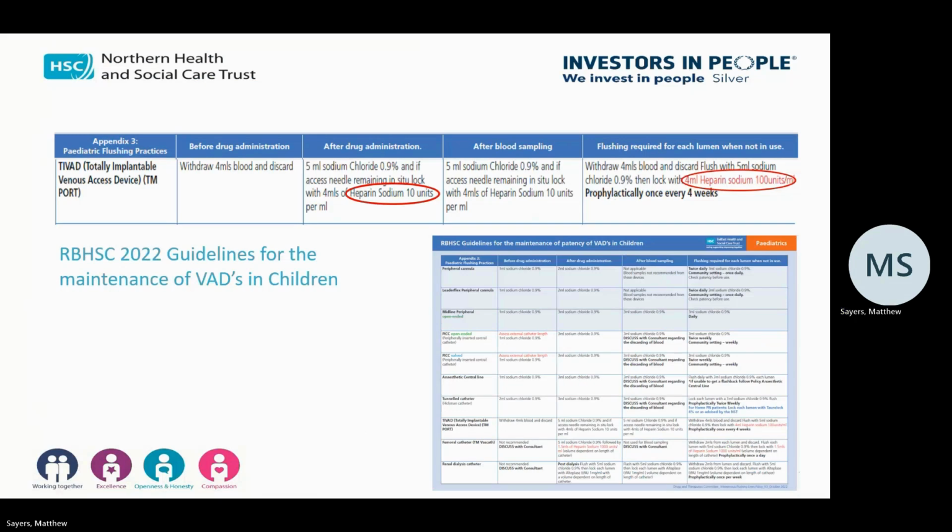The other thing just to note, and Lisa did do it, but I was talking about something else, is to finish off your flush on positive pressure, because that helps minimise the reflux of blood into the tip of the catheter that could create a clot and block it. So as you're doing your last push, you clamp, so there's positive pressure.